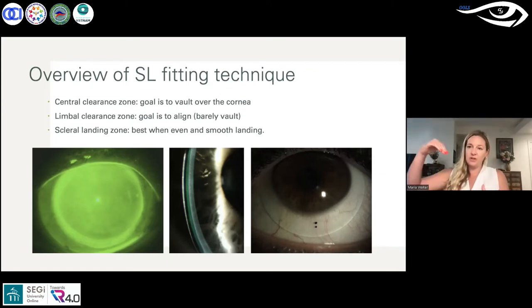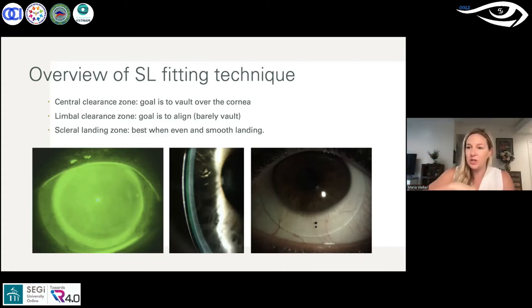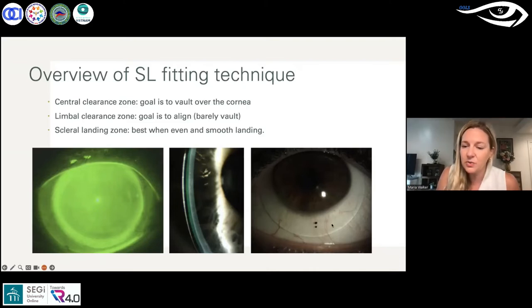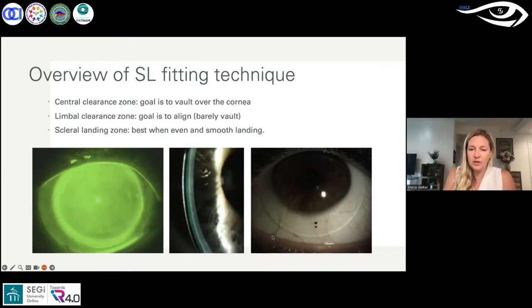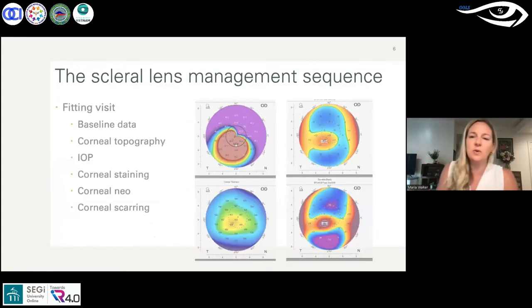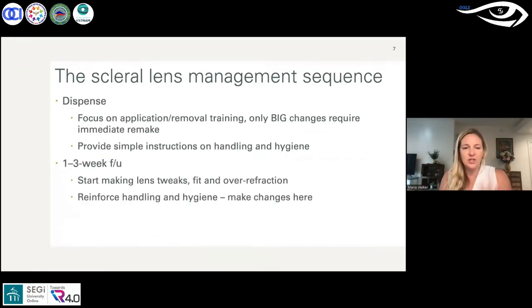If you have a lot of limbal clearance, you either don't land until the very edge of the lens — which impinges the landing area — or you land so sharply onto the conjunctiva that it impinges just inside the lens edge. On the right-hand image, a lens that looks pretty good has blood vessels uninterrupted going through to the conjunctiva. I'll talk more about the scleral lens management sequence when we're actually doing the cases.